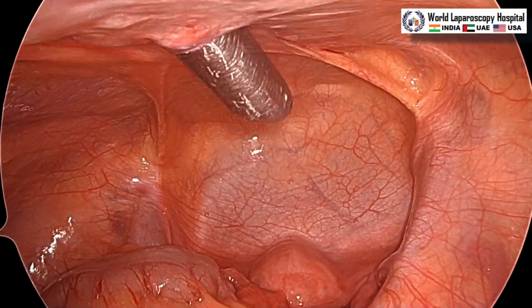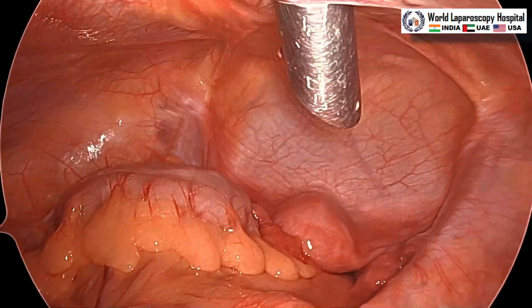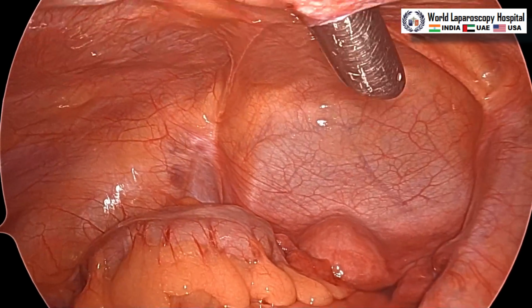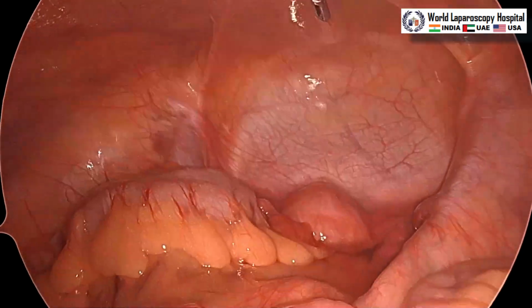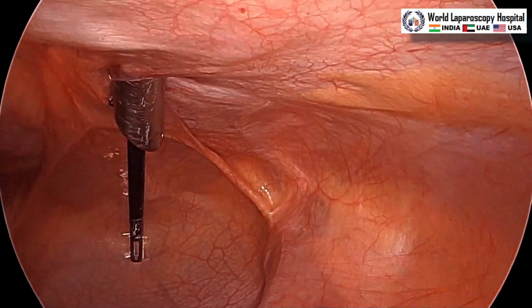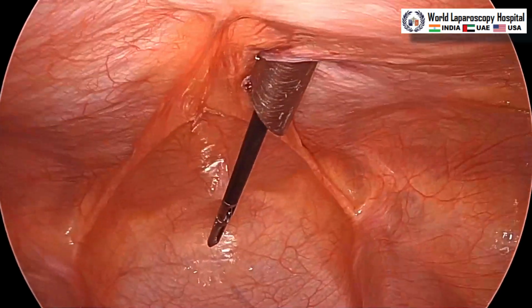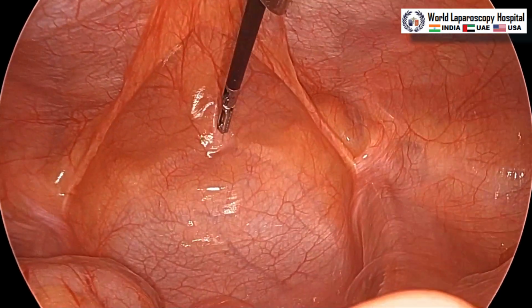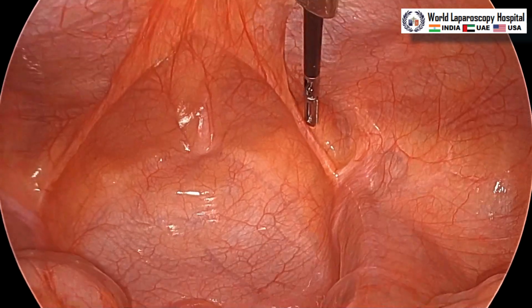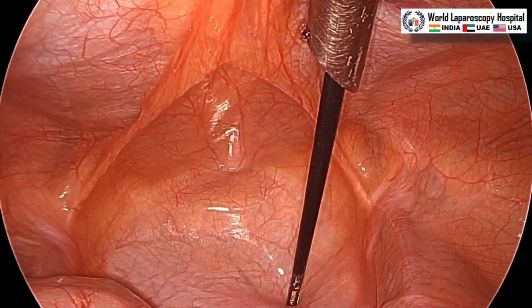For the anatomy, we can see all these activities were done by the umbilical port, the same port through which we did the cholecystectomy, and we will perform the other surgery. So no extra port is used. Now this is the median umbilical ligament, that is the obliterated urachus. This is all bladder in front, and these are the two medial umbilical ligaments. This is one medial, and the bladder is in between the two medial umbilical ligaments. This is the bladder.